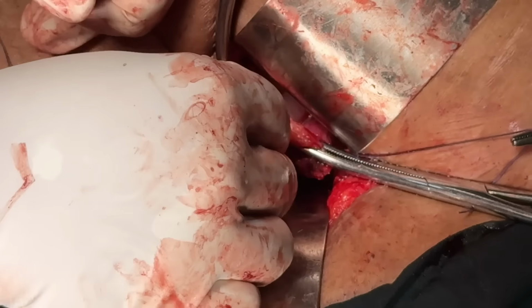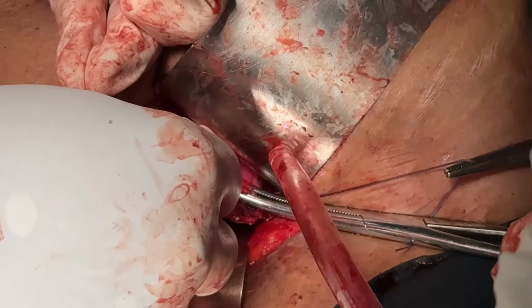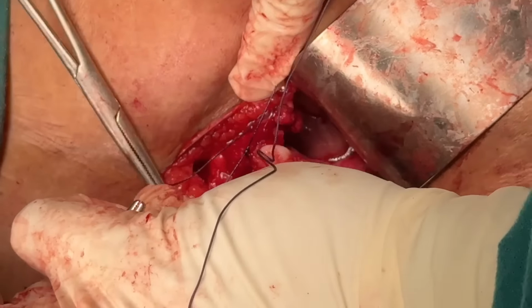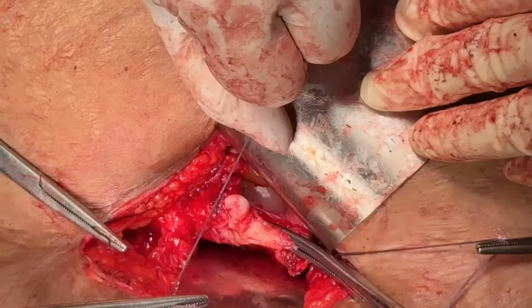Again, remember that the knot should be tight, and as we are going deeper in the pelvic cavity, you can use 2 fingers or a finger and a thumb to push your knot down and tighten it adequately.